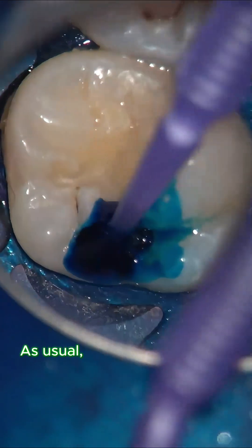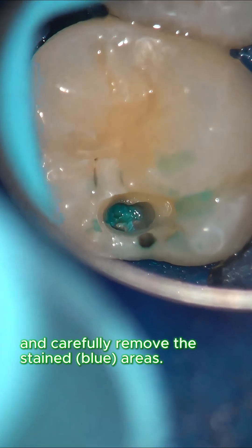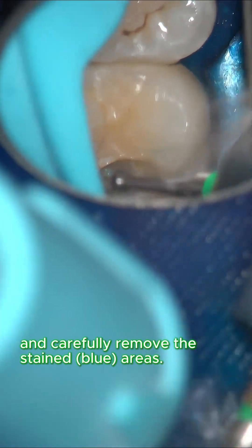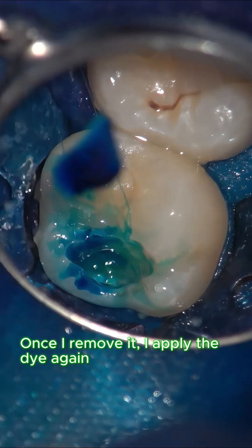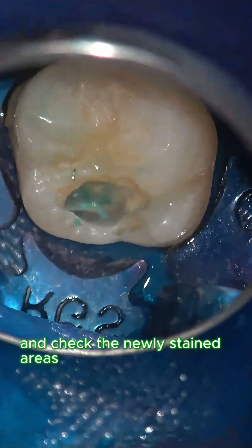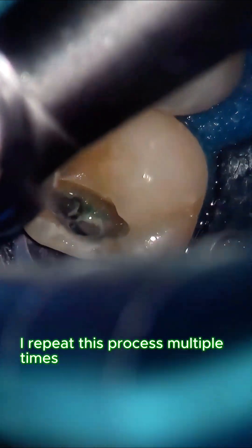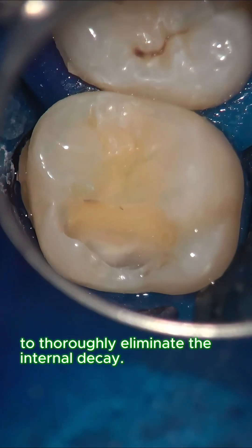As usual, I apply caries detector dye and carefully remove the stained blue areas. Once removed, I apply the dye again and check the newly stained areas, which I then continue removing. I repeat this process multiple times to thoroughly eliminate the internal decay.